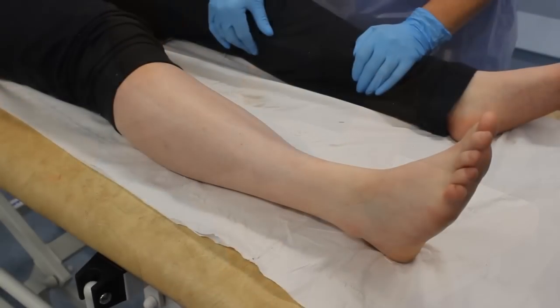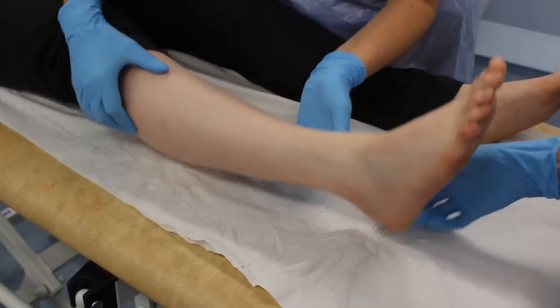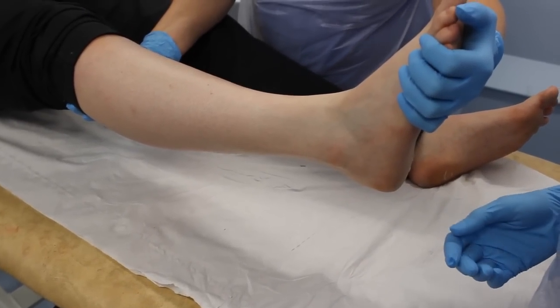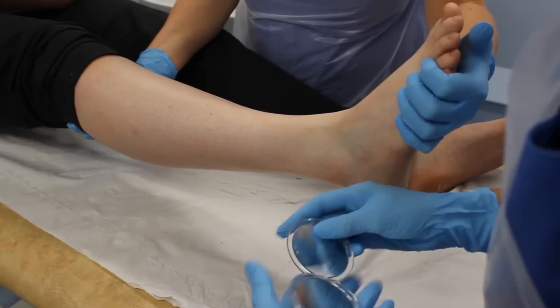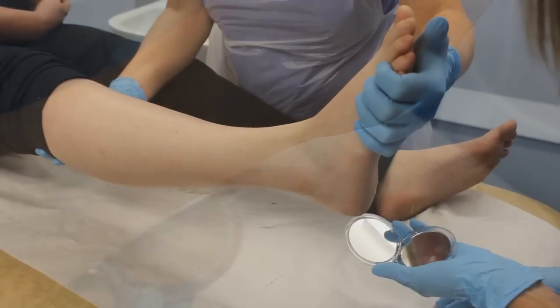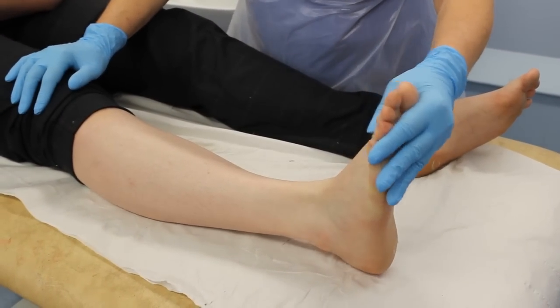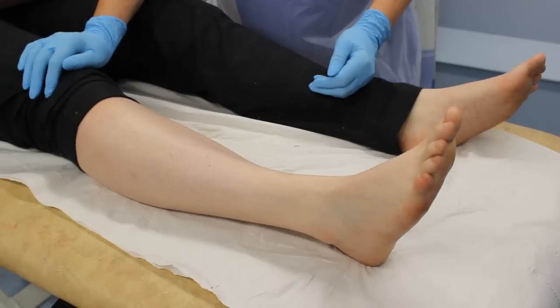Reverse this procedure to reapply. The cast can be removed for checking skin integrity, for exercising either with physiotherapy or at home, and wounds can also be checked. The cast can also be removed for bathing and showering purposes.